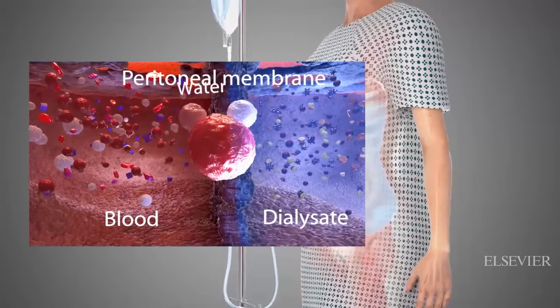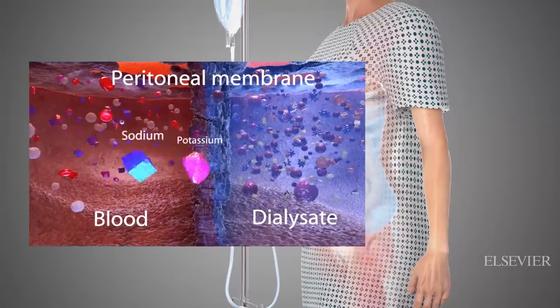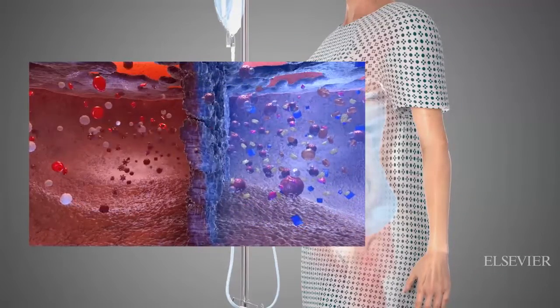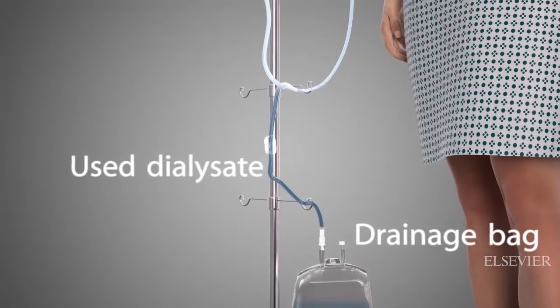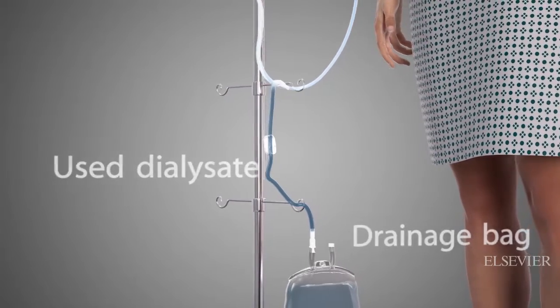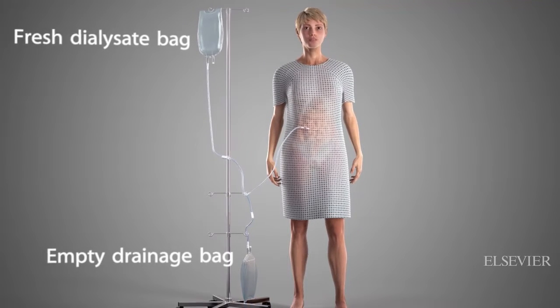Here, the vascular peritoneum acts as a semi-permeable membrane, allowing the exchange of wastes, fluids, and electrolytes through osmosis, diffusion, and filtration. In the outflow or drain phase, the used dialysate flows out of the body by gravity into a drainage bag. The duration, number, and frequency of peritoneal dialysis exchanges vary with the patient's condition.